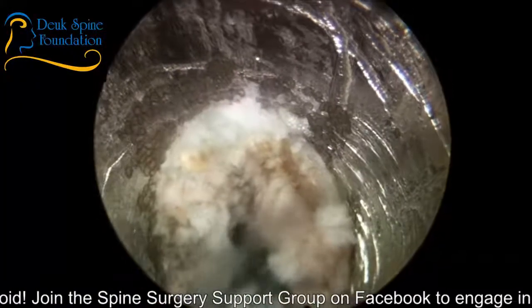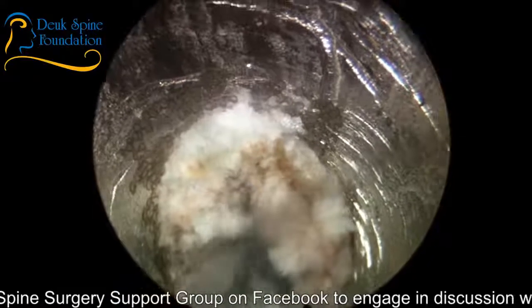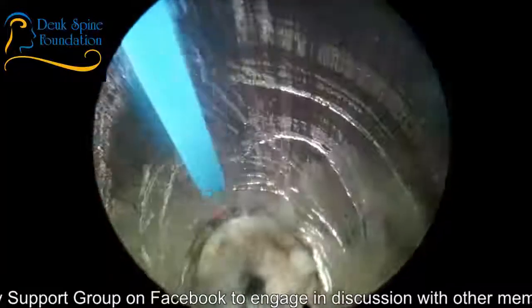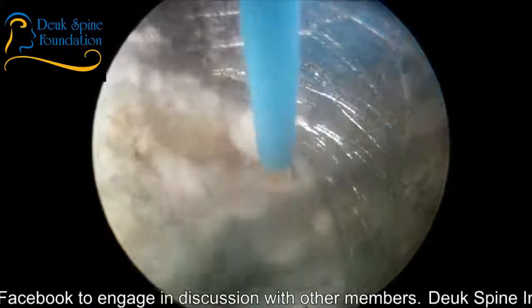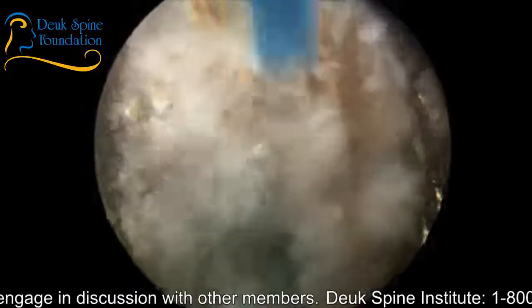How do we know this patient had 2 bad discs? Well, number one, I saw it on his original MRI that he brought in, but also I saw that, shoot, Luis, what is that? See it? The line going from, yeah.